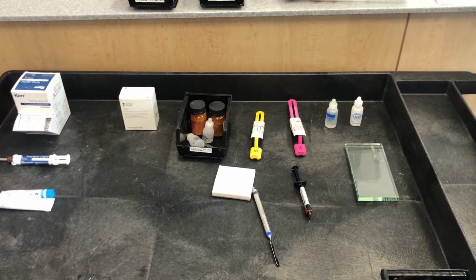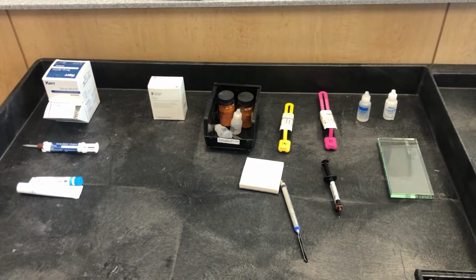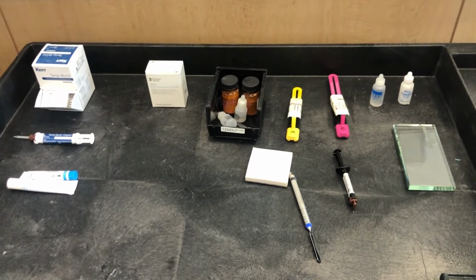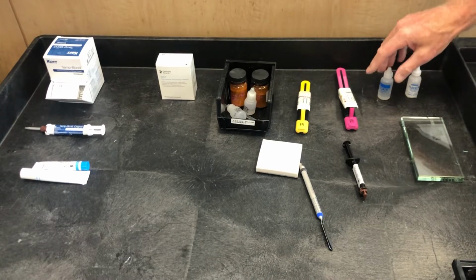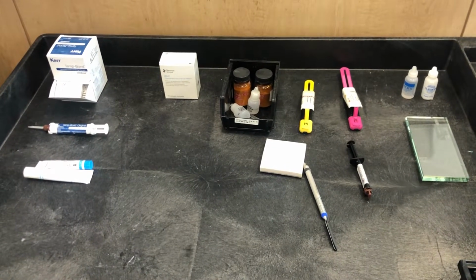Questions from module 122 on cements. There's a lot of stuff. We go back through kind of the history of cements, the evolution of the glass ionomers, the evolution of the polycarboxylates, and the zinc phosphates, which the zinc phosphate you'll probably never use.